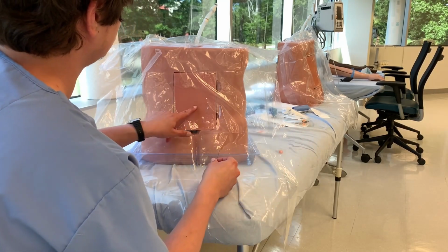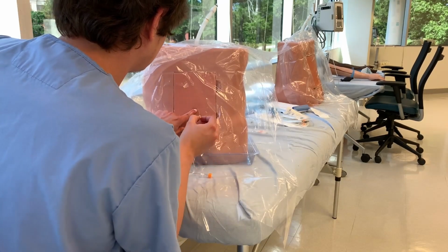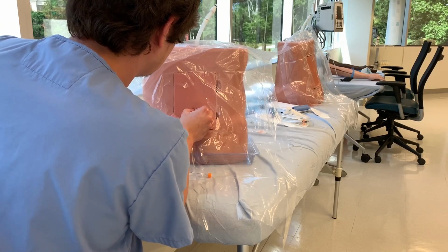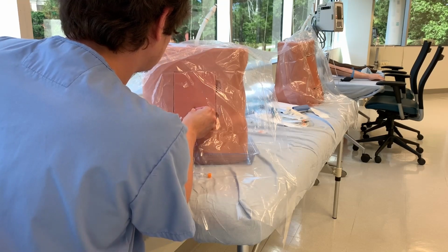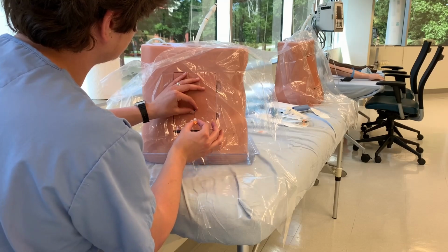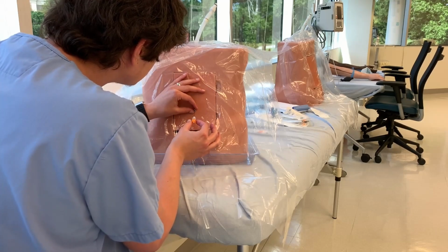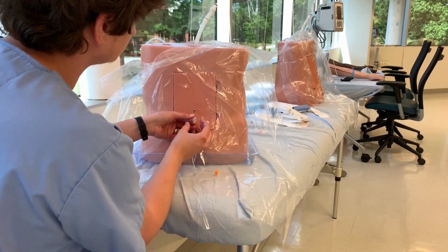Now we have an introducer needle, and this is the needle that the needle goes through. A little jump cut for technology issues. Finding my path, finger on the posterior process, and then pushing in the introducer. Now in comes the spinal needle. Trying to line it up, it's a little bit finicky. And out comes the stylet.